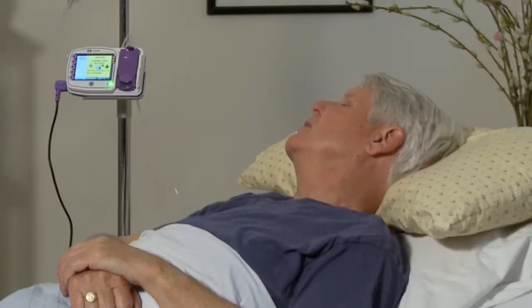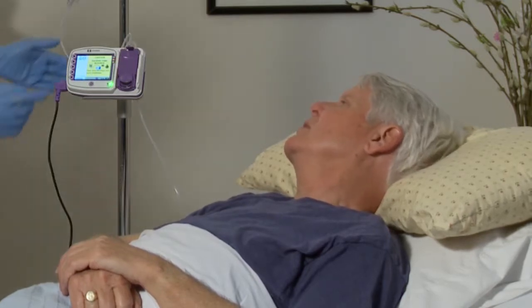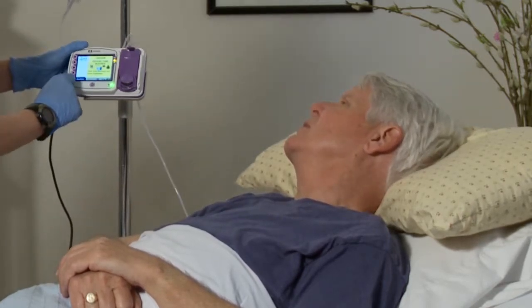Once the dose limit is reached, the pump will stop operation with feeding complete, but will not sound a feed bag empty alarm. This is especially useful for nighttime feedings.